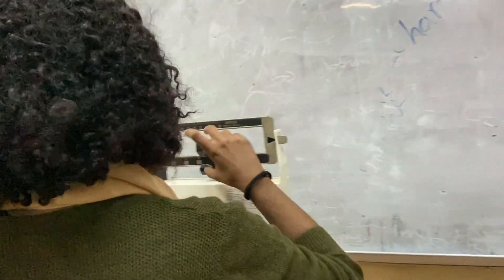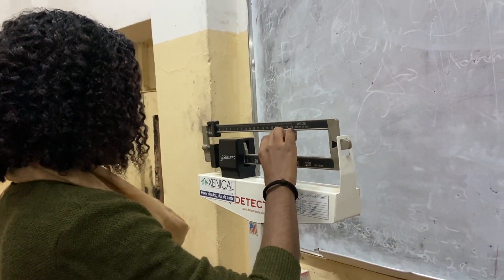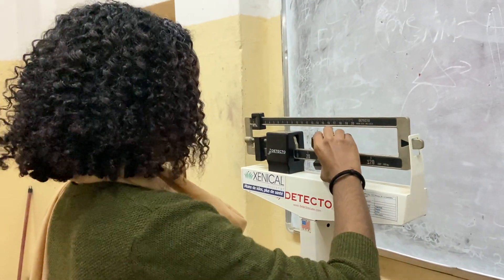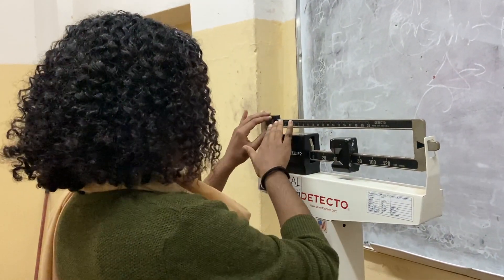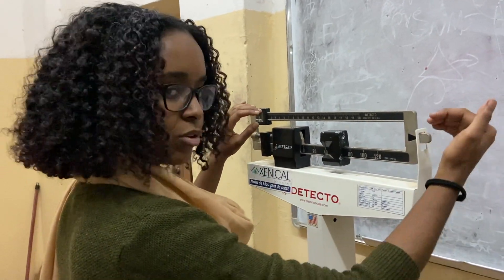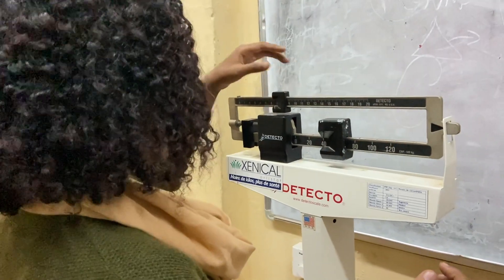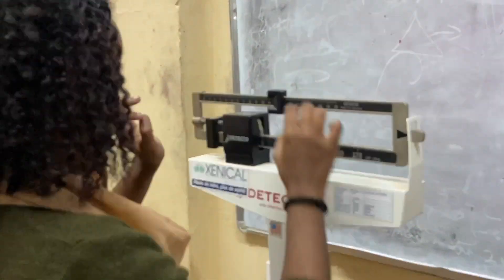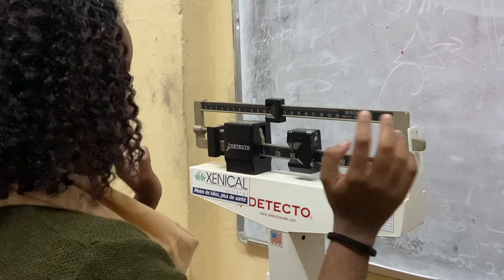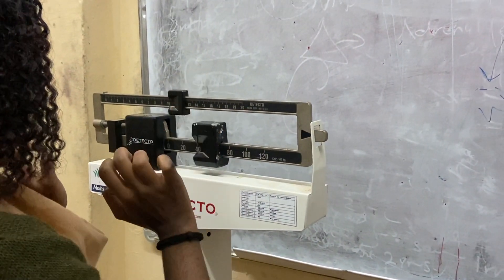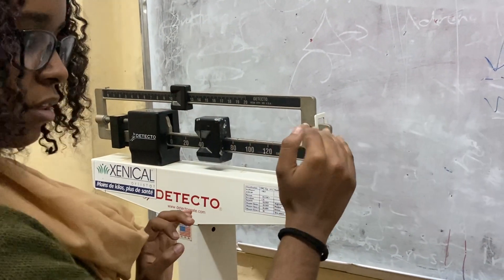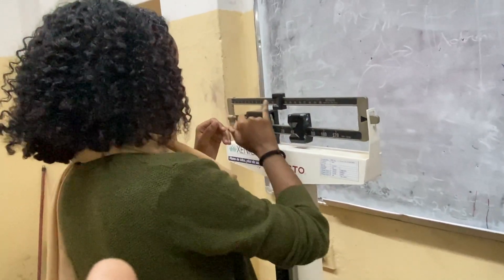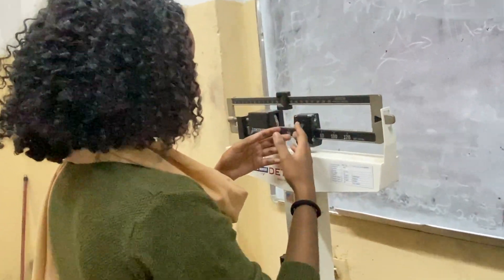You'll see it go down. Then go back until it's above. In the beginning it's below. So we're going to go back — we're going to be at 40. Then we're going to go again with the smaller one until this one starts floating in the middle. If it fell, that means this is too much, so go back a little. Once it starts floating in the middle, that means you're at the correct measurement. You read the bottom and the top and add them together. So this is 40, and this is 10.5, so the weight is 50.5.